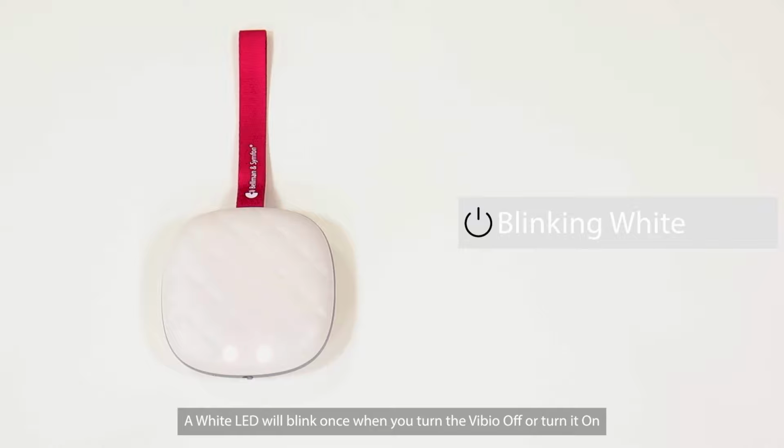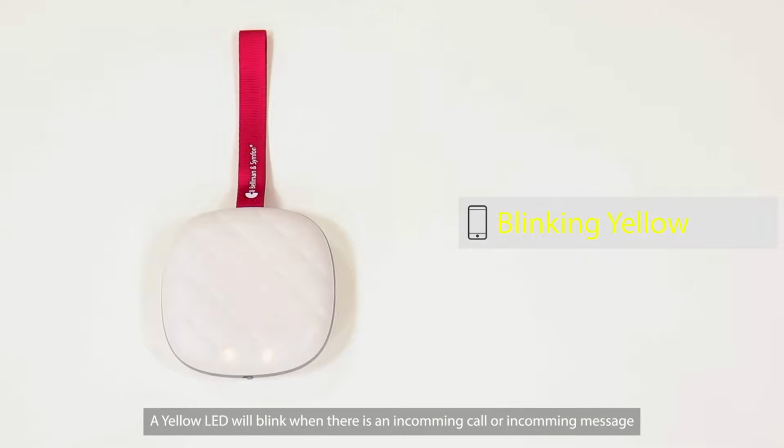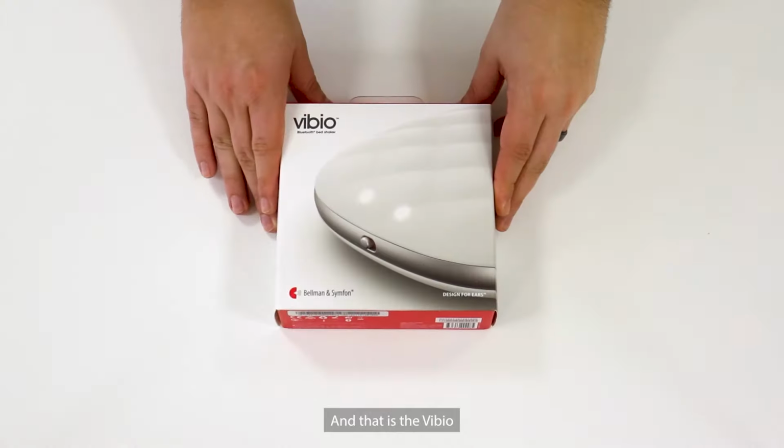A white LED will blink once when you turn the Vibio off or turn it on. The white LED blinks 4 times after an alarm or a setting has been changed. And a white LED will blink continuously when the alarm is going off. A yellow LED will blink when there is an incoming call or incoming message. And that is the Vibio.